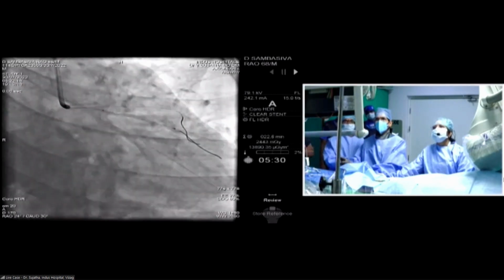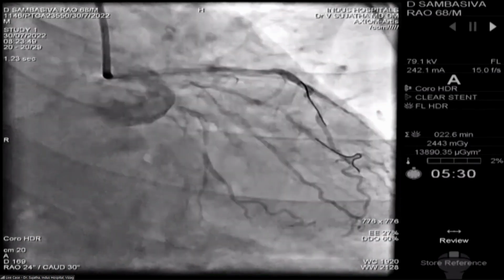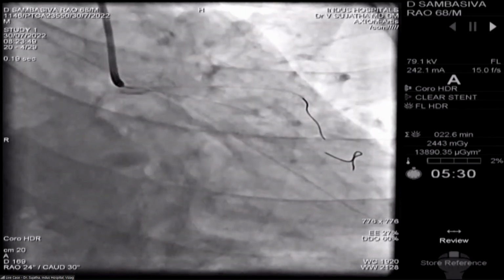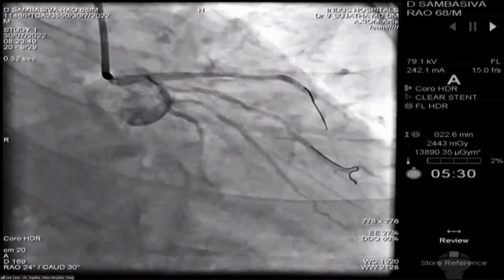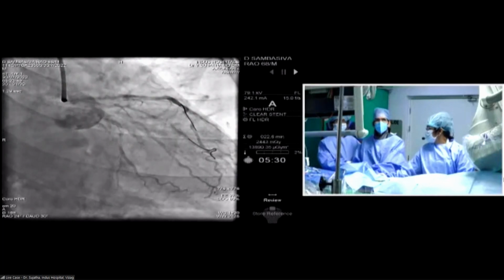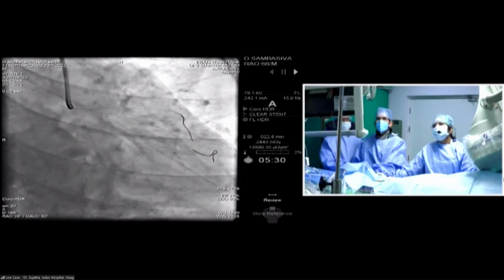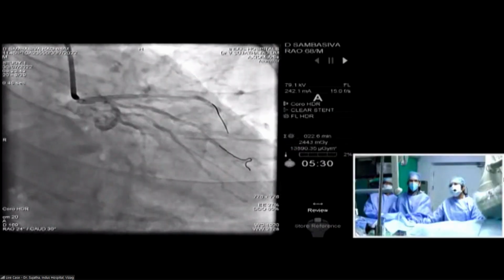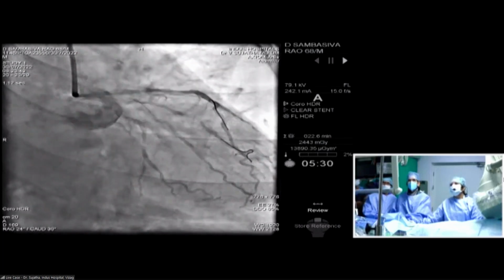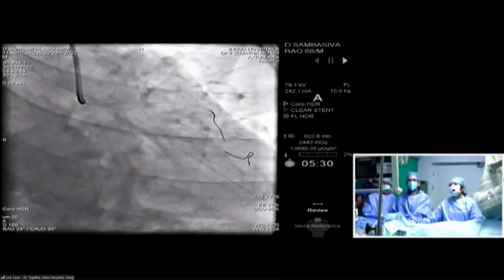Unfortunately, in the United States, we don't have it. So this is after the balloon. This is another important measure. What Madam demonstrated is that a drug-eluting balloon should be used like a stent. Preparation has to be done with a balloon before, and then take this and inflate it to nominal pressures, and according to the recommendation, inflate it for 1 minute. And the result has come out quite okay, madam. People say that even if there are mild dissections, it's okay as long as flow is maintained after DEB. But here the result looks quite good and encouraging.